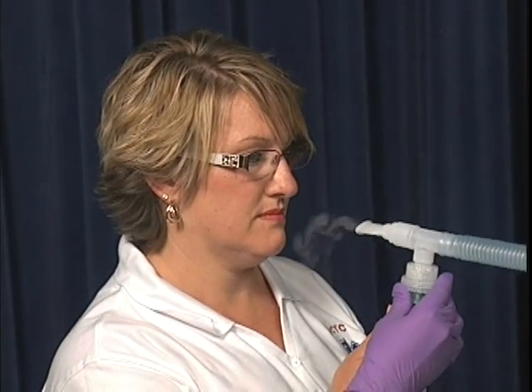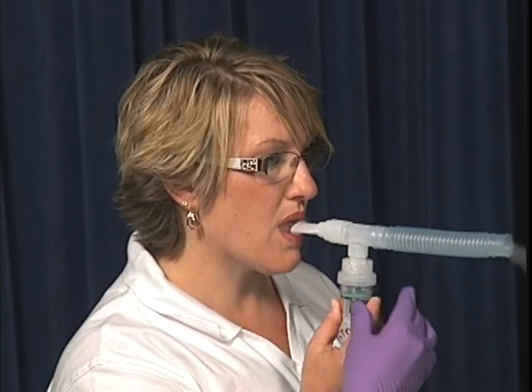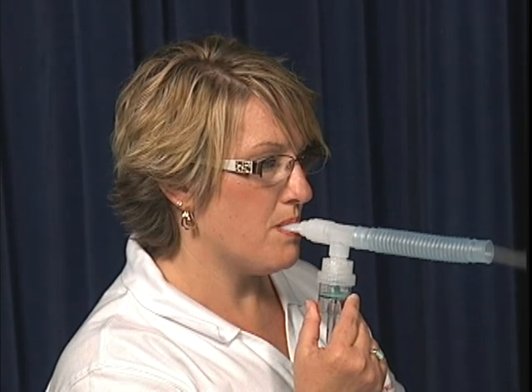Explain the procedure to the patient. Have them seal their lips around the mouthpiece of the handheld nebulizer and take slow breaths and inhale as deep as possible. Encourage the patient to hold their breath as long as they are comfortably able to, and the mist should disappear with each breath.